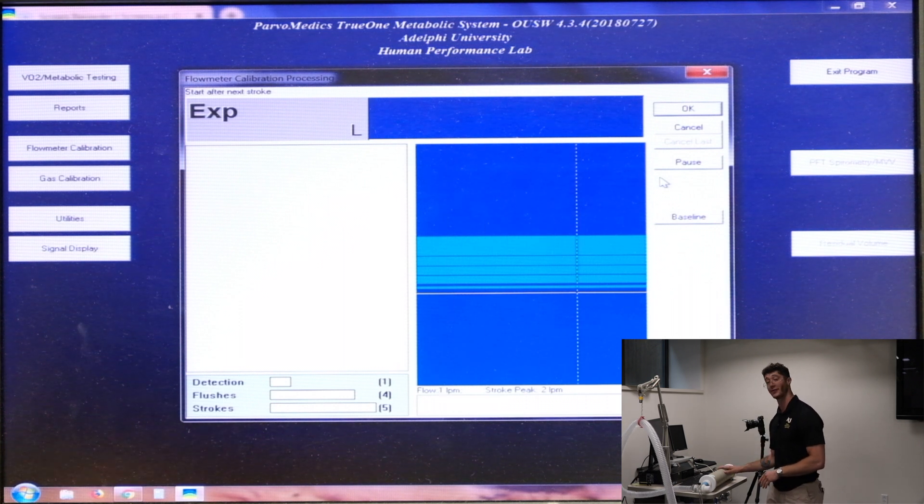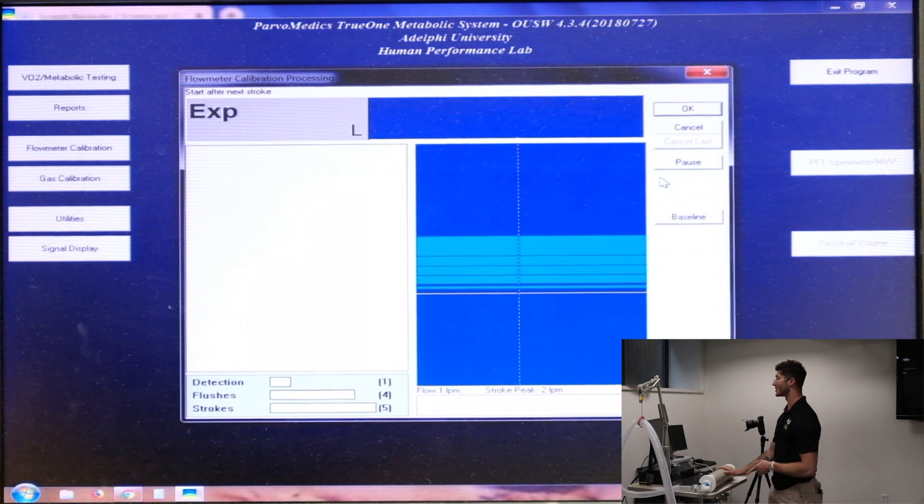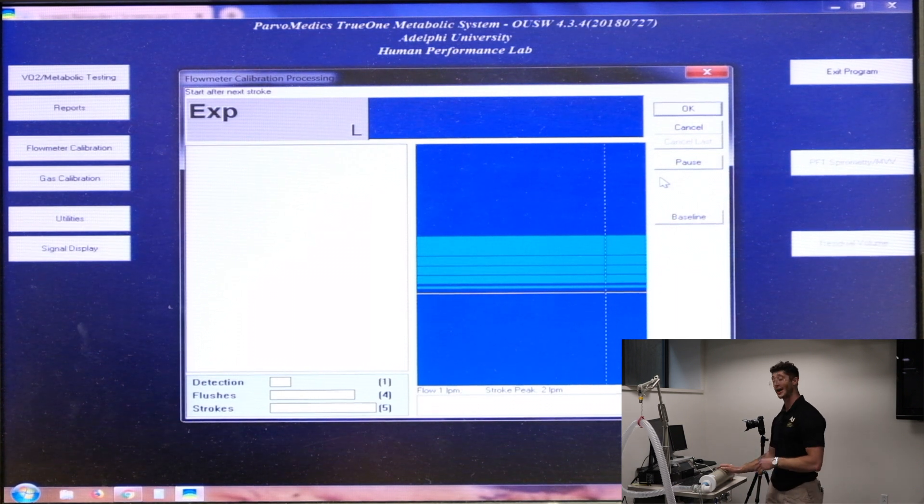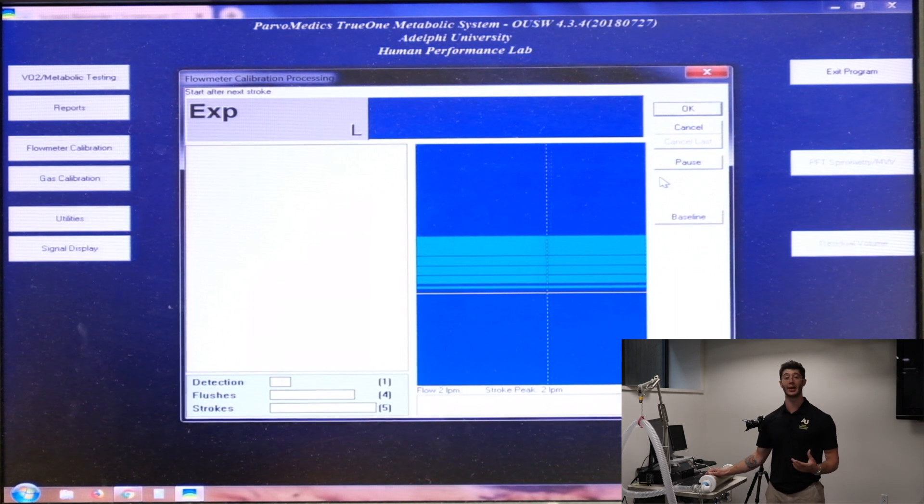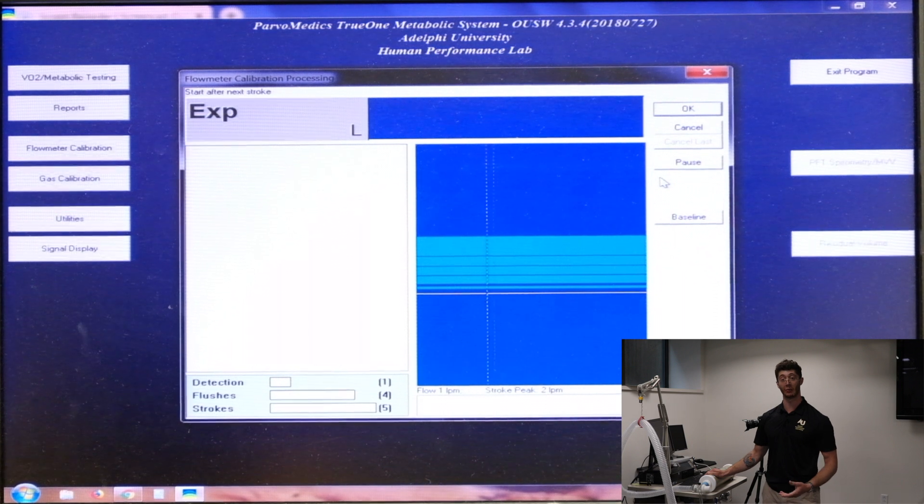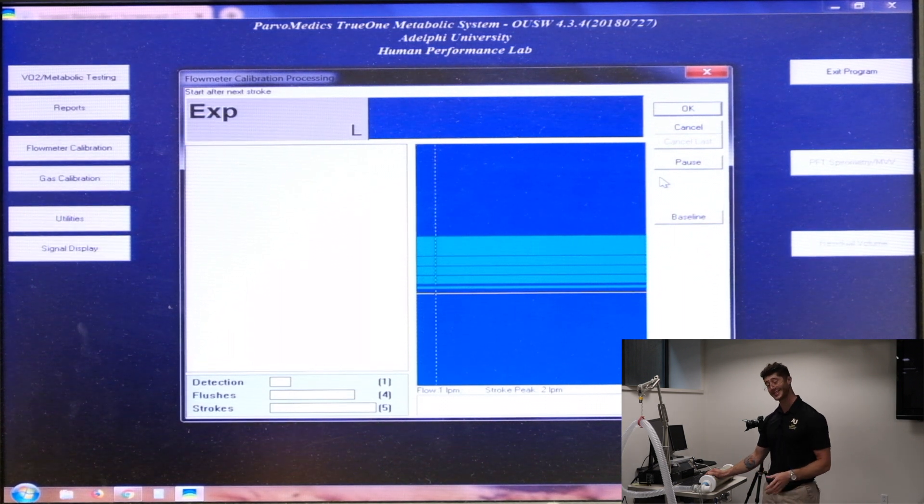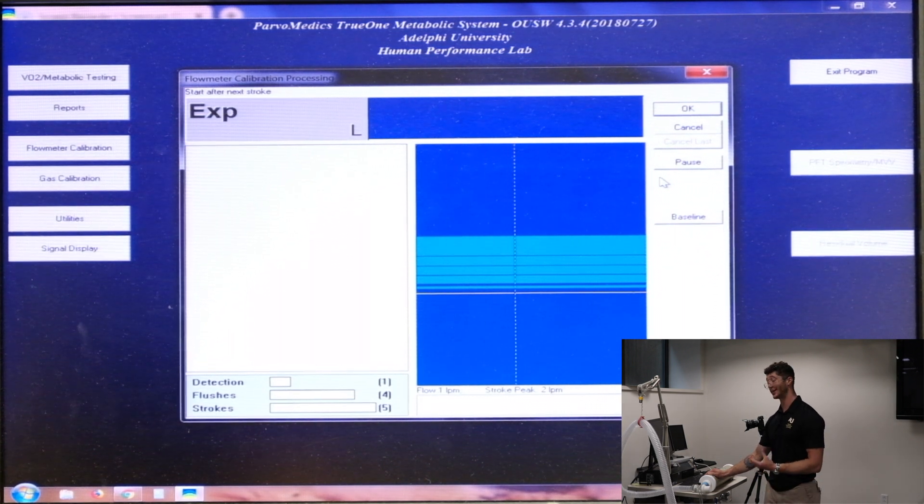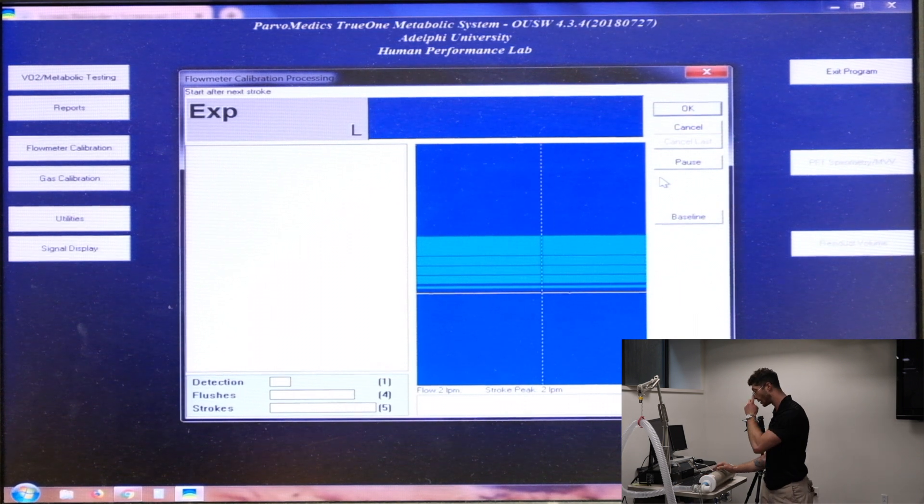We're taking three liters of air, pushing it through this system at different velocities to simulate the changing breathing rates during a test and calibrate based on those differing velocities.